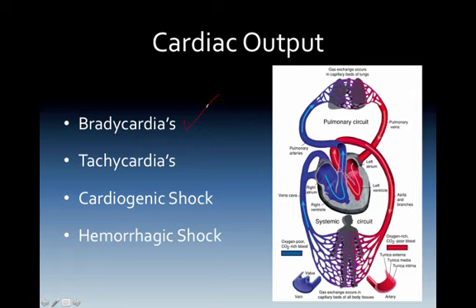In cardiogenic shock, trending in end-tidal CO2 with lower CO2 levels may indicate a perfusion problem and be one of the earliest signs of us understanding that the person is going into a pump-related shock. Hemorrhagic shock, assessing effectiveness of fluid resuscitation. Simple principle, when enough fluid is on board, perfusion and CO2 will return and increase through the sampling.